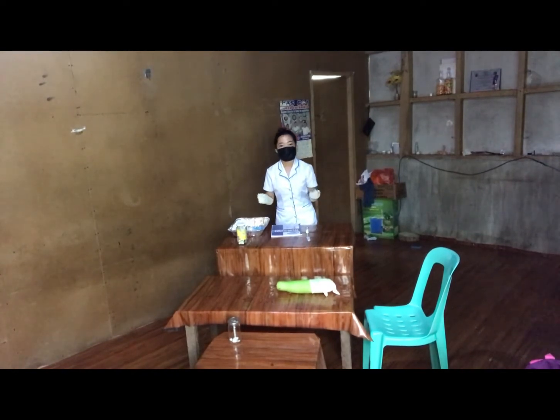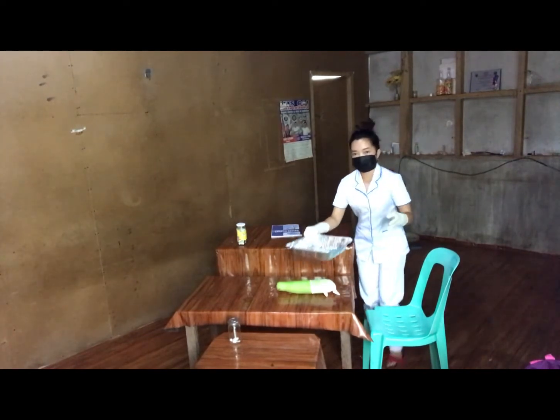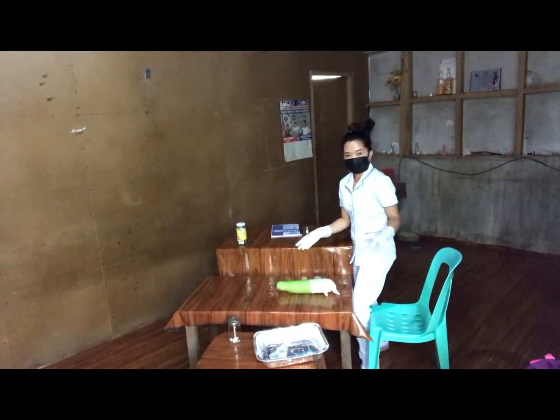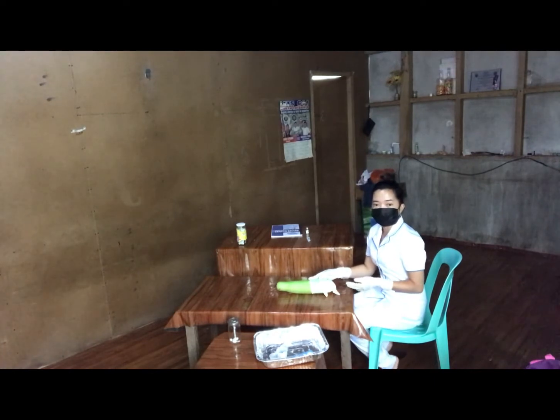So now we're going to perform the injection of the medicine via the intramuscular site, and we're going to use this green vegetable for administering the medicine. I will put this to the patient. So let's assume that this is an intramuscular site of the patient.